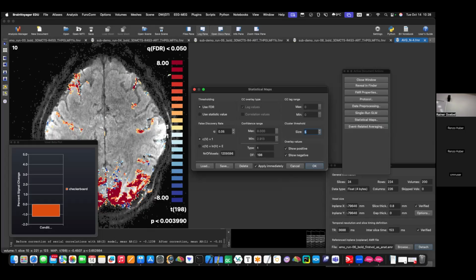A bit of attention in the frontal eye field. You attend to your checkerboard. This could be, I don't know. Is there a task? I think there's no task. So there was no task, right? It's just passive viewing, or did they have to press buttons? No. Yeah, that's what I thought. But I mean, this is undisputedly mega strong, but even these other areas, which you do not see so often, are coming out nicely in passive viewing.